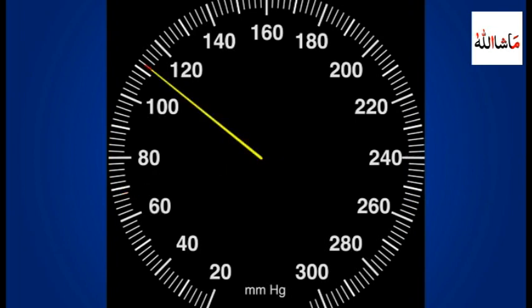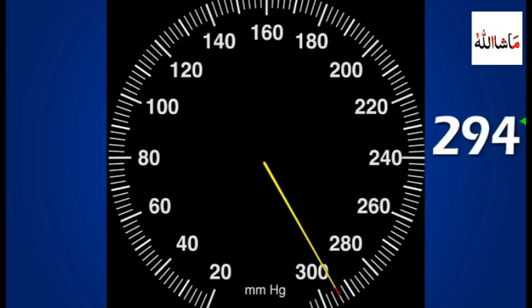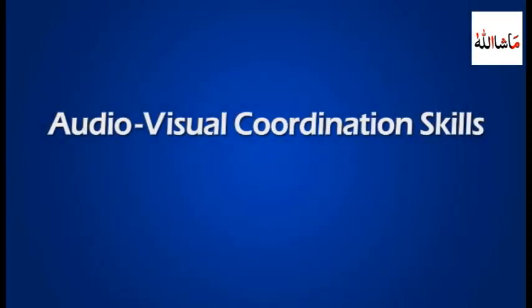So how much does this line represent? If you stated 112, you are correct. And how much does this line represent? If you stated 294, you are absolutely correct. Great job. Now that you're comfortable with reading the blood pressure dial, let's apply audio-visual coordination skills.